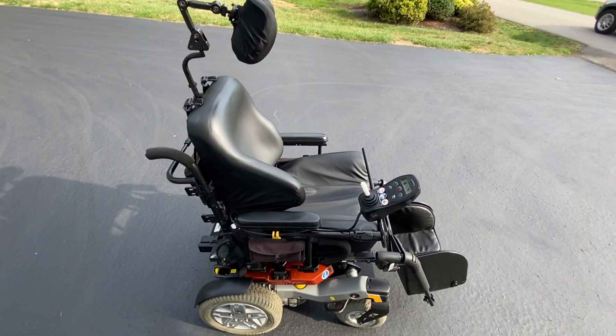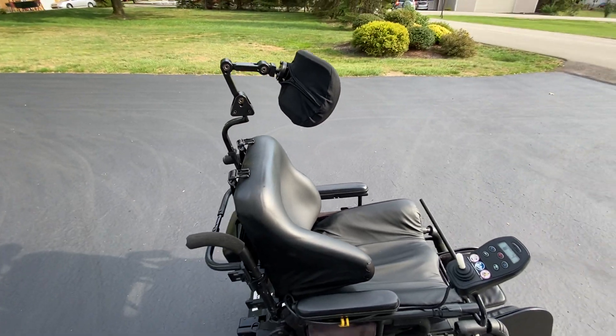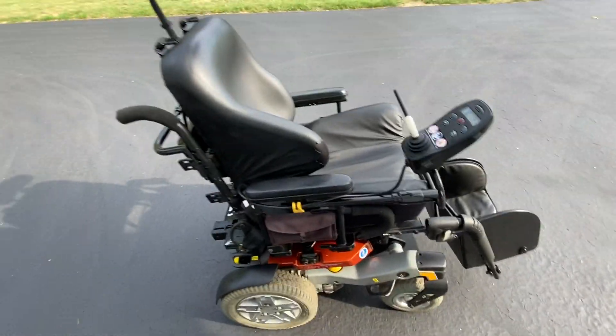Hey guys, what's up? This is Ameriboy16, and today I've got a little bit of a treat for you guys. I'm doing a review on a Quantum Rival power chair.